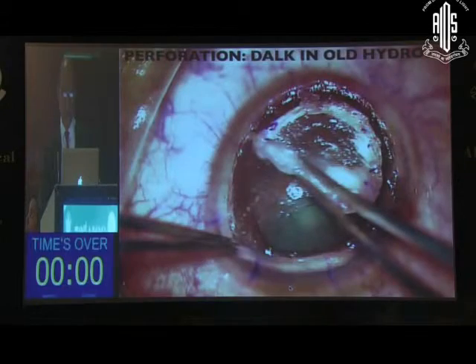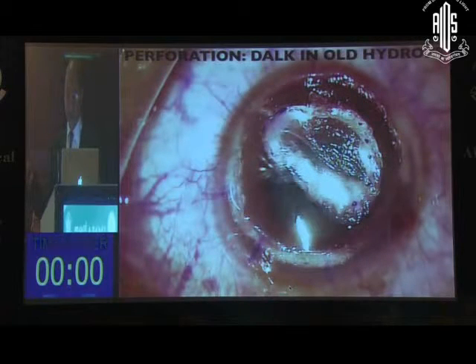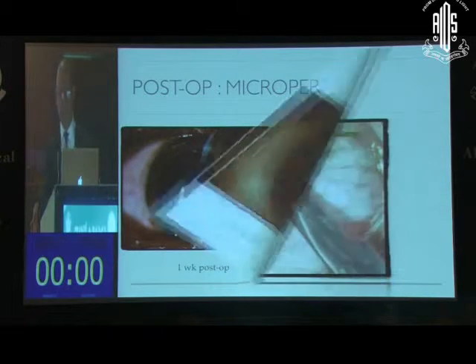Again, here you can see this is a manual dissection, the same technique. This was a patient with old hydrops. Perhaps not a good idea in this kind of a case. You get a perforation, but if you manage it well, you can see that triangular perforation there, but still the patient gets a very good result.